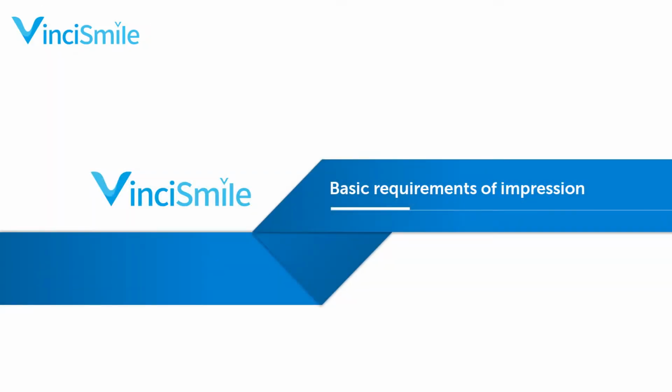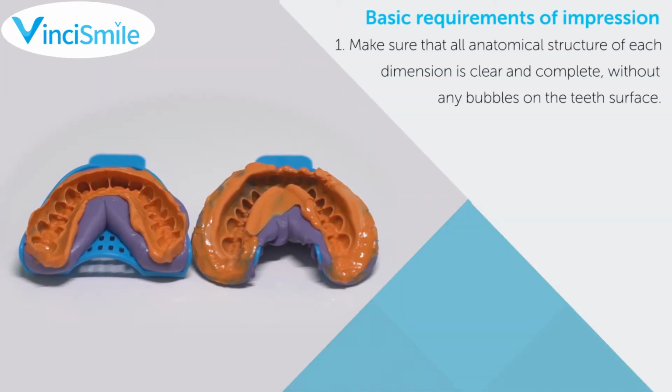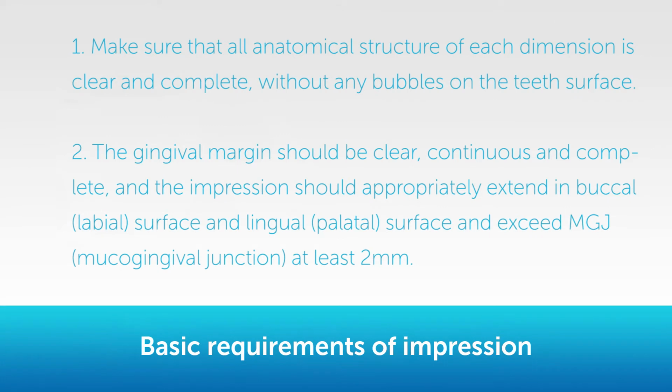Basic requirements of the impression. 1. Make sure that all anatomical structure of each dimension is clear and complete, without any bubbles on the teeth surface. 2. The gingival margin should be clear, continuous and complete, and the impression should appropriately extend in buccal, labial surface and lingual-palatal surface, and exceed MGJ, mucogingival junction, at least 2 mm.